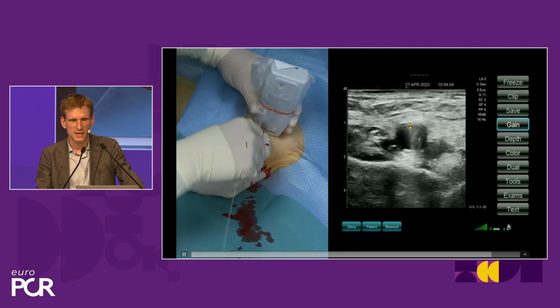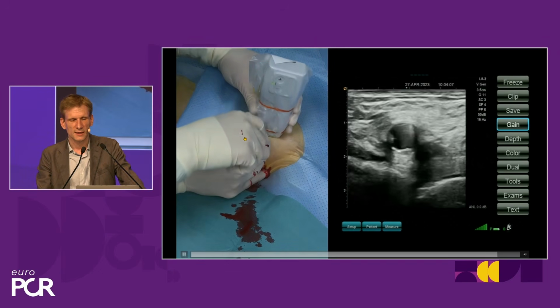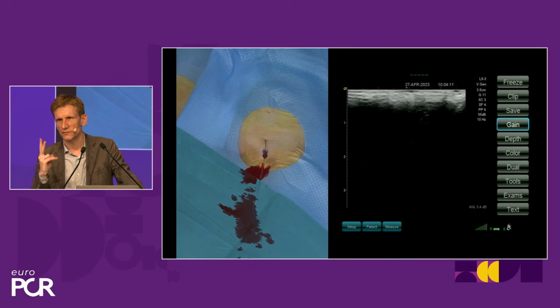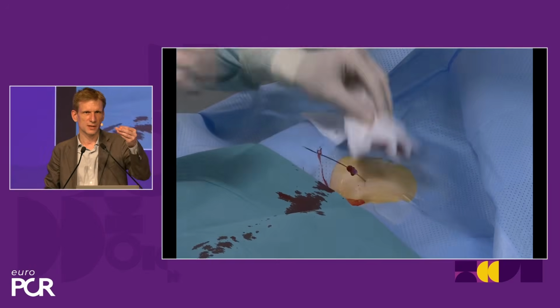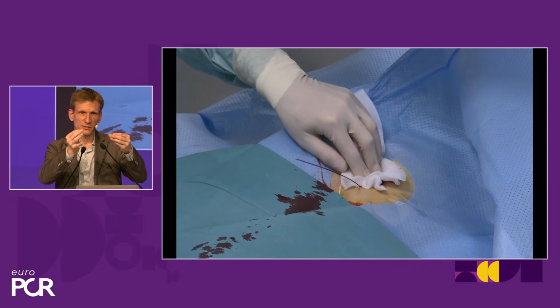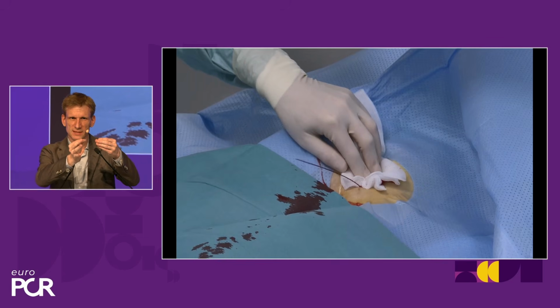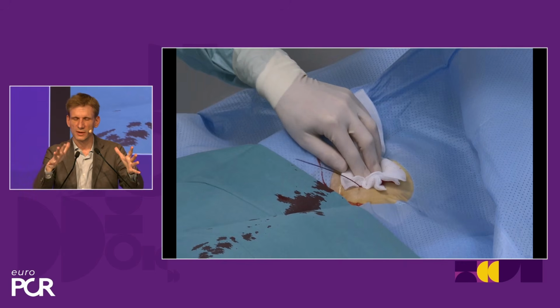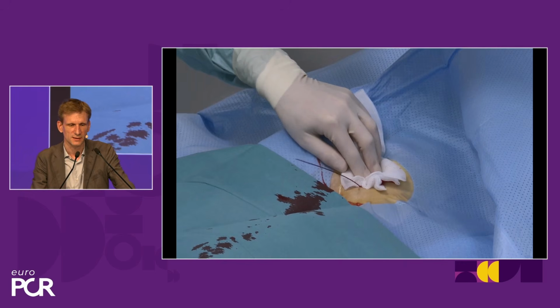I would say that's a shame, because on echo you can nicely see the infiltration just above the adventitia. Here you see we had a nice puncture in the middle, and I would say it's not mandatory, but it's almost easier if this is an act of two people, where one person is holding the echo with the left hand and has the needle in the right hand. He just does everything he can to really be good. When he sees the tenting on the top of the artery, then his second operator, a fellow or a nurse, has the wire ready, and as soon as he's in the artery, the wire goes in. Yes, it works really elegantly if you do it that way. So I think that's for the access.